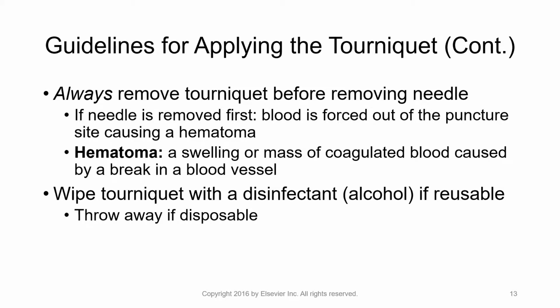Always remove the tourniquet before removing the needle. This is a must do. I have seen blood come out at a pretty rapid trajectory, pretty good trajectory. I've seen people get squirted in the neck, in the chest, in the face with blood if they do not remove the tourniquet.